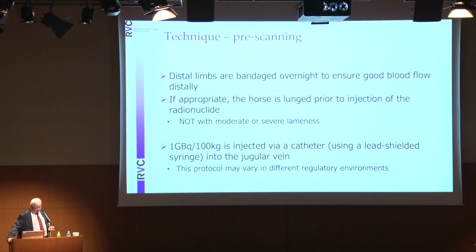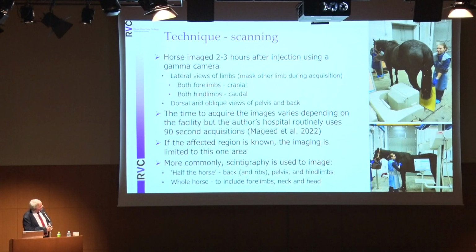When the horse is scanned, which is about 2 to 3 hours after injection, we use the gamma camera.